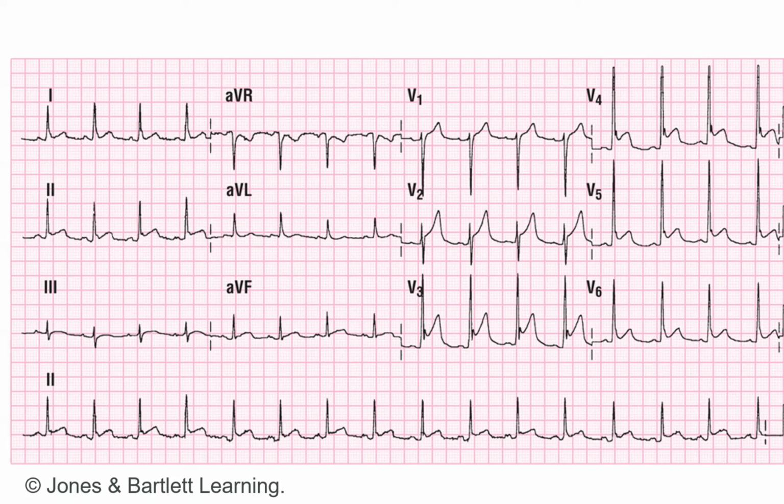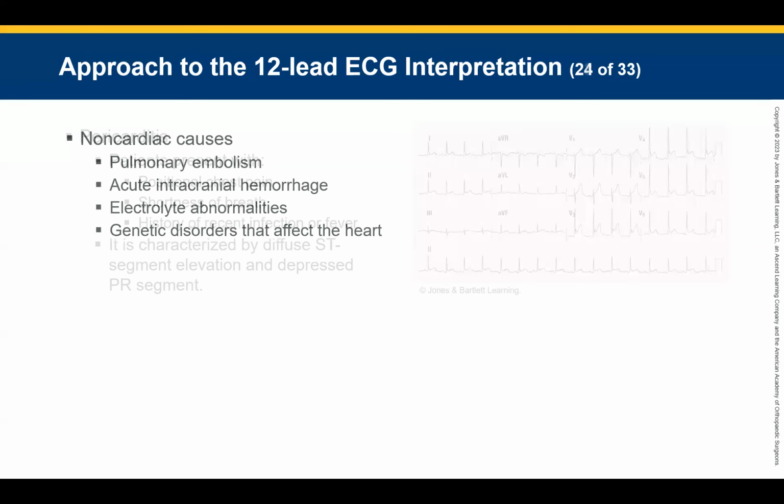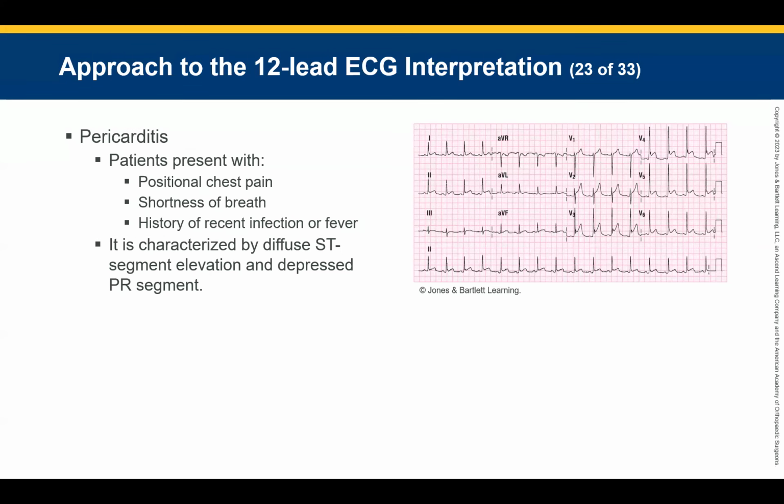They should be going opposite directions. In this case, we see it in 2. We said, man, that looks like it had some in 2, right? Yep. And then we also have it down in 5 and 6. That doesn't match. That doesn't jive. It shouldn't be like that. Which means this is probably a mimic. And what we hear, it's pericarditis.